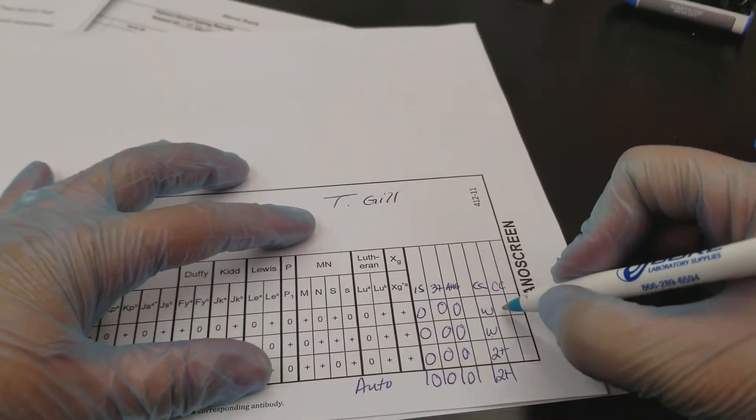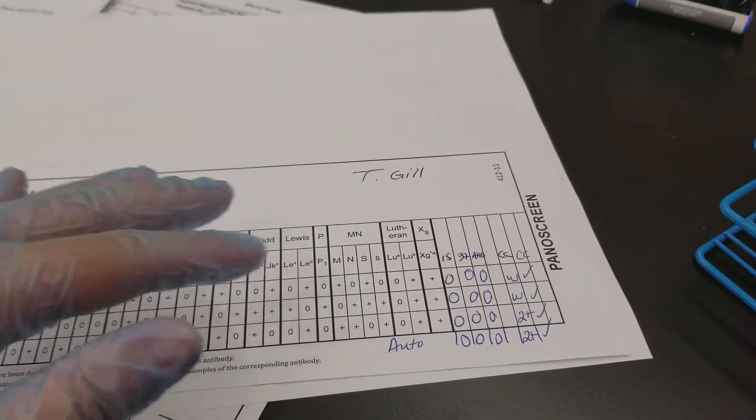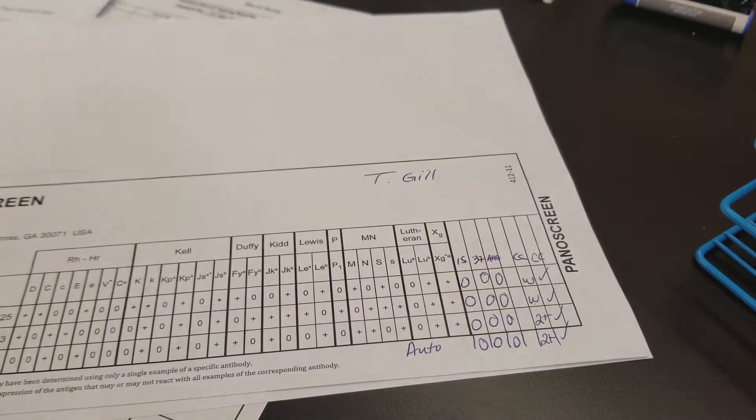In the lab when you're a bench tech, you actually just put a check mark there. But for teaching purposes, I like to put the reaction strength to show students that it did react and also to see if our reagents are still good. In a clinical facility, you would just write 'check.' That's also why they're called check cells — you're checking that the reagent is still active. You don't need to record anything for a tube that was already positive.